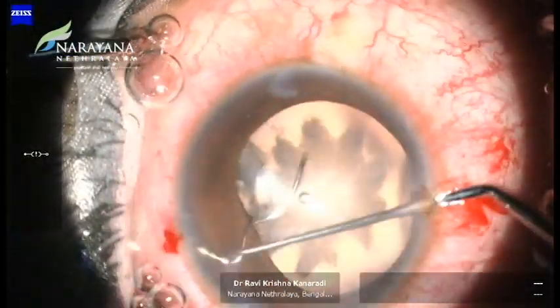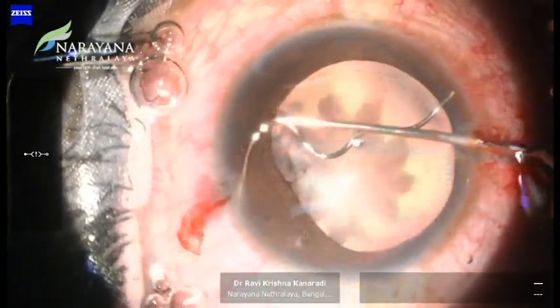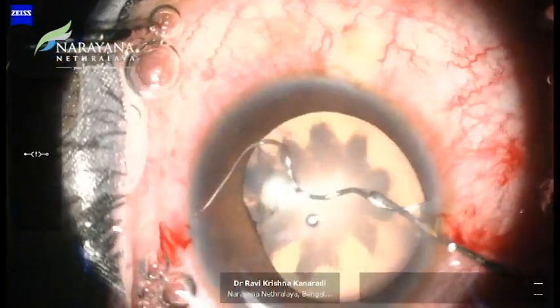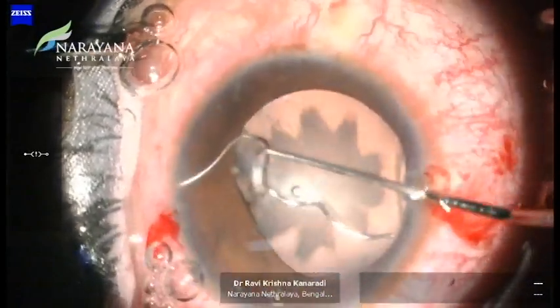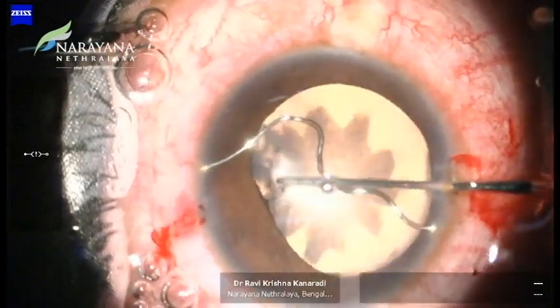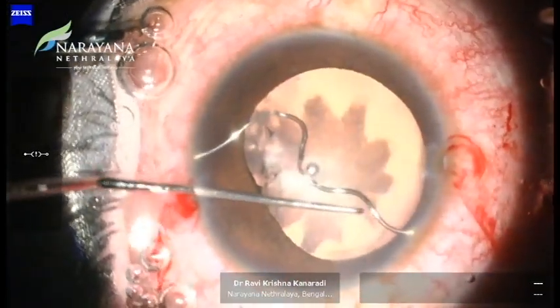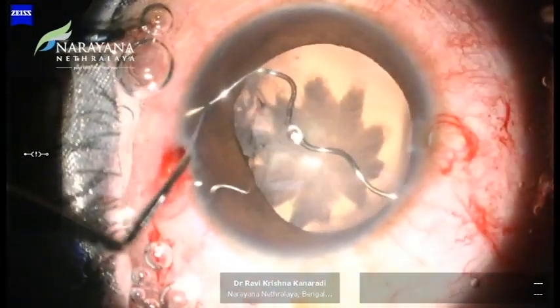Here we also observe that one end of the foreign body, the metallic wire, is visible while the other end is tucked away in the angle. We gently maneuver the foreign body entirely into the AC using a Sinski hook and tried orienting it in the direction of the main port. It is of utmost importance to follow the track of the wire in order to avoid creation of false passages or injuring the iris.